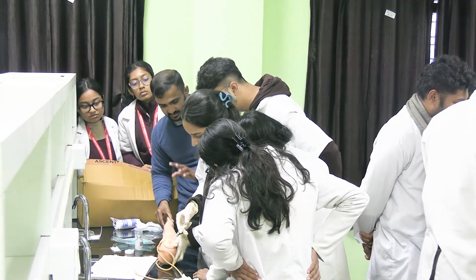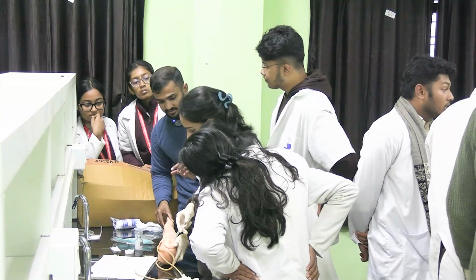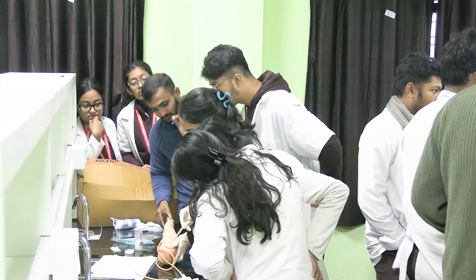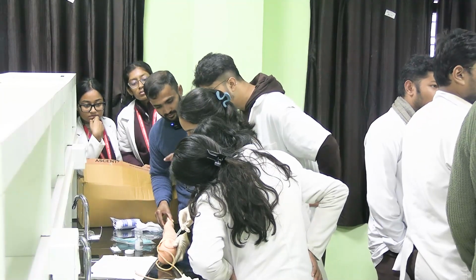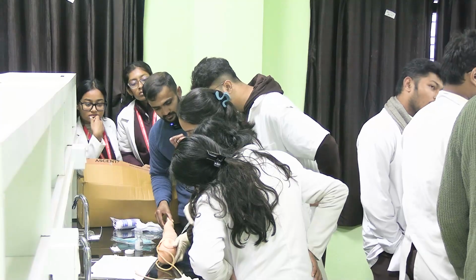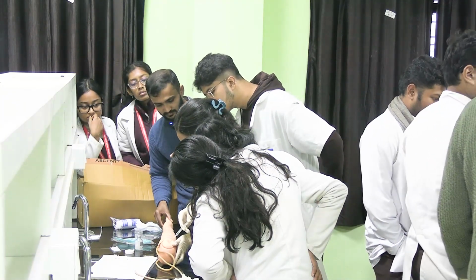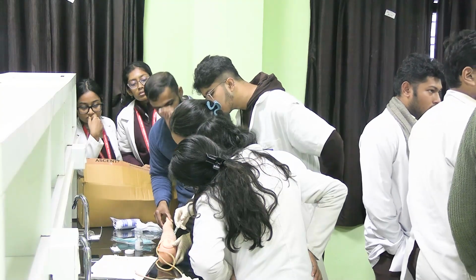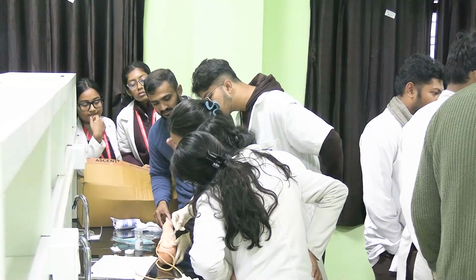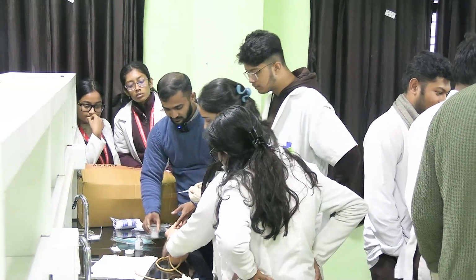So when you will be injecting it, how should you inject? It should be fast and firm. Quick. Go quick, inject the needle there. No, you have not injected, insert it. It is not 90 degrees. 90 degrees means properly perpendicular. Don't inject now, just insert the needle. Remove the needle. Take the solution again.